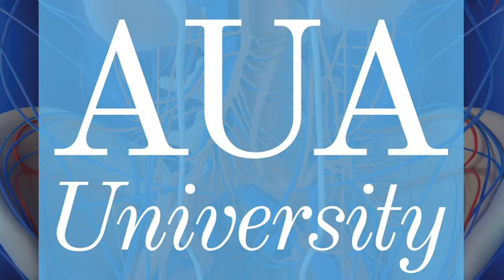The balloon may be placed over a wire to the point of resistance under fluoroscopy or direct cystoscopic visualization. The balloon is used to dilate the urethra at the location of the stricture. Direct vision balloon dilation can be performed if the appropriate balloon dilators are available. Balloon dilation applies radial force on the stricture with less shearing force. Balloon dilation may decrease the risk of anterior urethral strictures by avoiding serial dilation and associated repeat instrumentation.